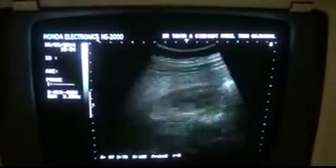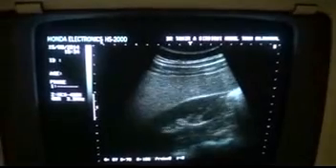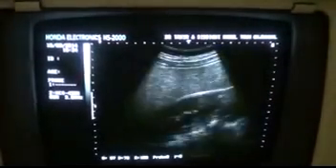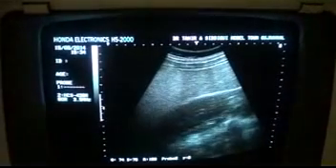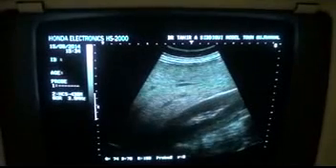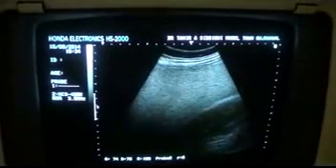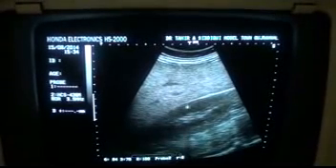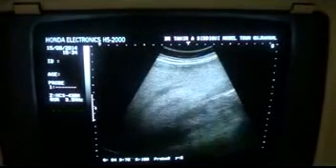Now when we see it with a fatty liver anterior to it in longitudinal section, we can't make out the details. And if I raise the gain, even then it's difficult. I have raised the gain significantly, but even then it's not possible to make out the detail of the kidney.